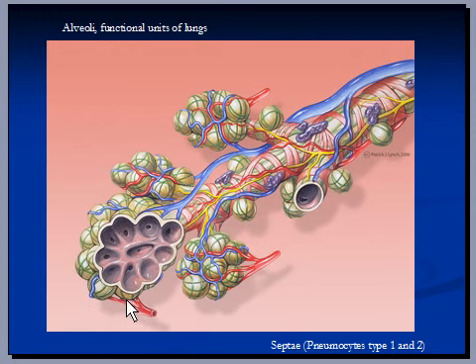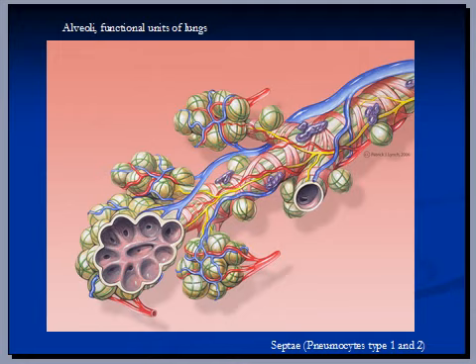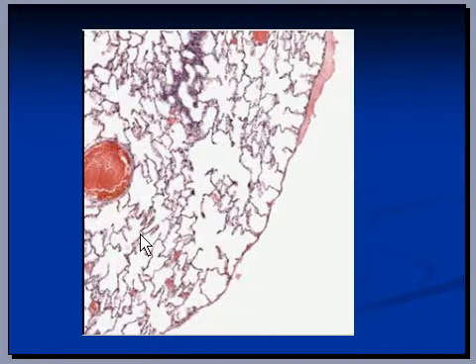This oxygenated blood is returned back to the heart with the help of these blood vessels known as pulmonary veins. These lines here are known as septae, which are made up of type 1 and type 2 pneumocytes. These alveolar septae are visible here, here, and here.